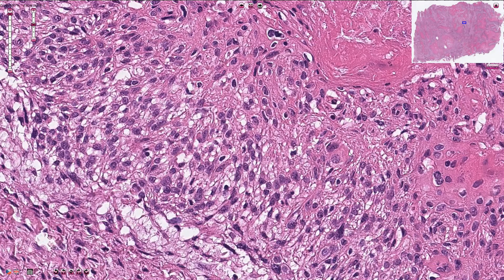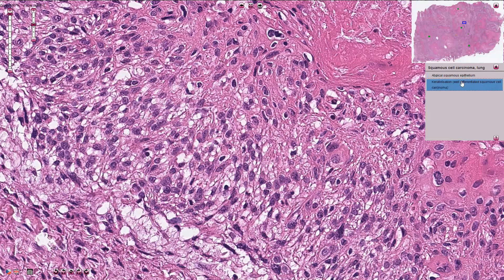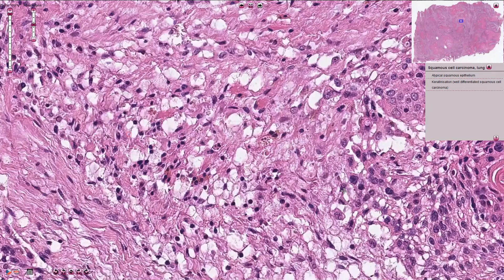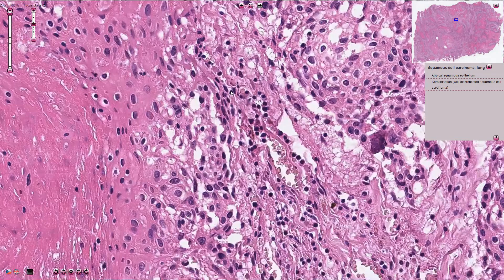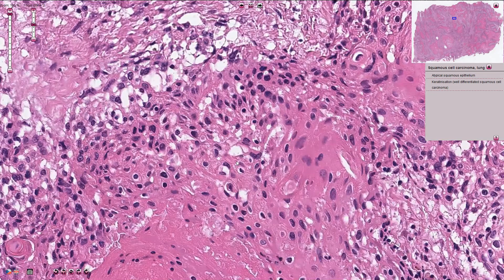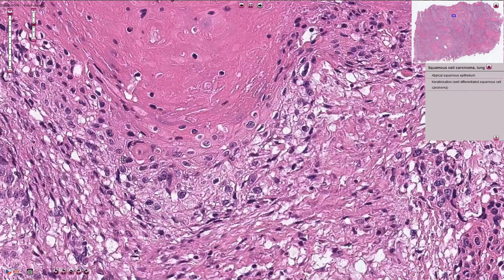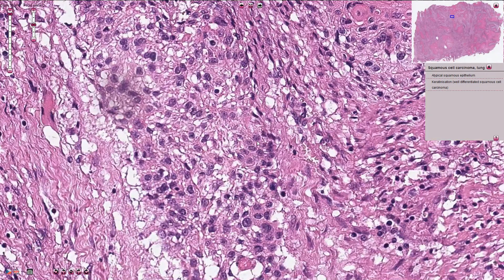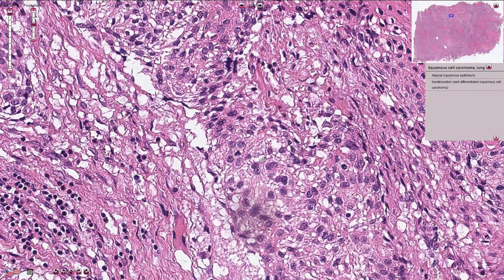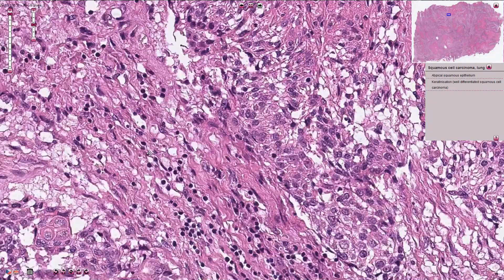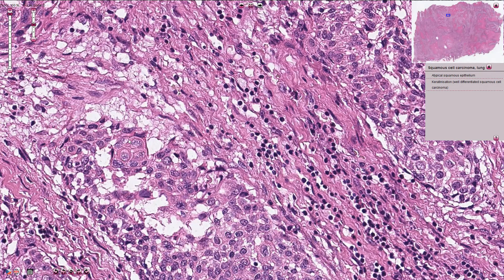Therefore squamous cell carcinoma is sometimes called spinocellular carcinoma — spinocellular carcinoma and squamous cell carcinoma refer to the same tumor. So let's see if we can find some intercellular bridges. This may be moderately differentiated squamous cell carcinoma where intercellular bridges are not prominent. But here we can see very tiny structures which are desmosomes in between the cells.